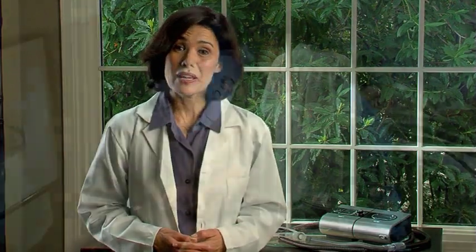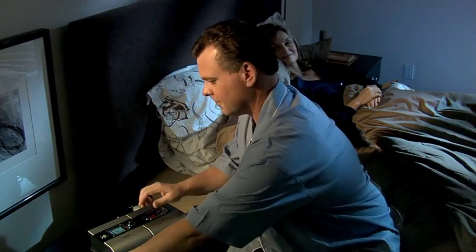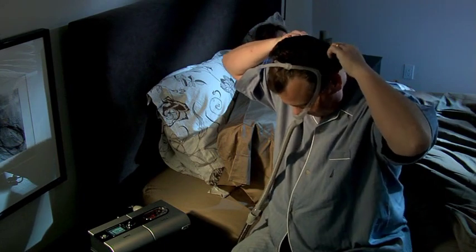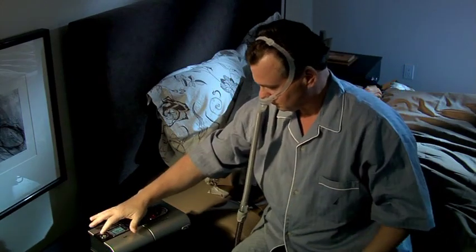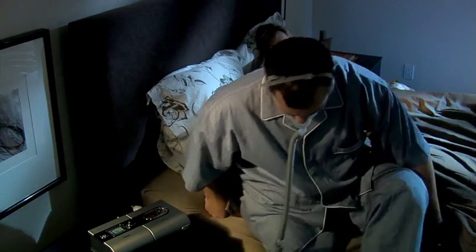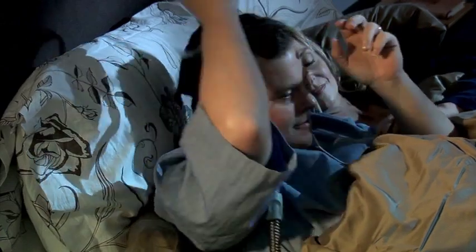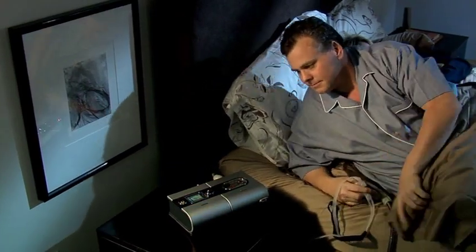That's really all that's required to get started. On a nightly basis, make sure the power is connected. Adjust the ramp time or humidification level if needed. Fit your mask as described in your mask user guide. Then, to start therapy, simply press the large start-stop button and breathe into the mask. Lie down and arrange the air tubing so that it's free to move if you turn in your sleep. To stop treatment at any time, remove your mask and press the start-stop button.